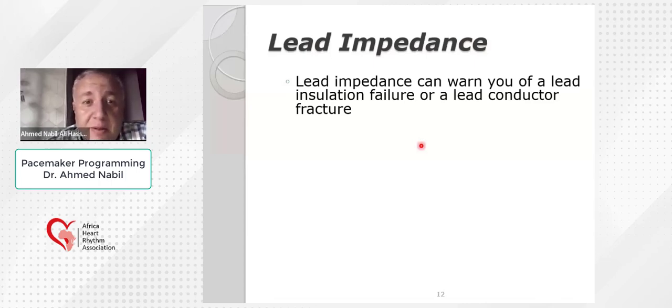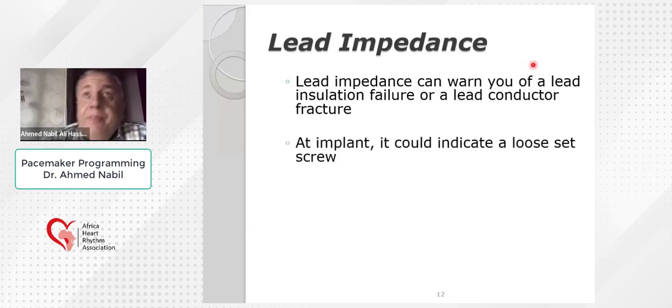Any abnormality in the lead impedance is a warning for us that there is a problem in the lead, whether an insulation failure or a lead conductor fracture.